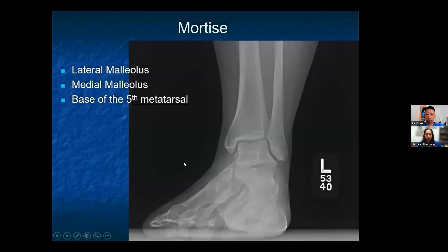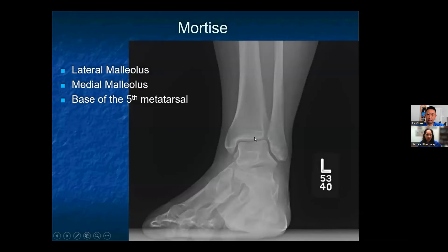When you're looking at the mortise view, the aim is to assess the articulation of the ankle joint. The lateral and medial malleoli should be in profile. The mortise should be uniformly visible, which is in direct contrast to the AP view, and then the base of the fifth metatarsal should be included in the view.